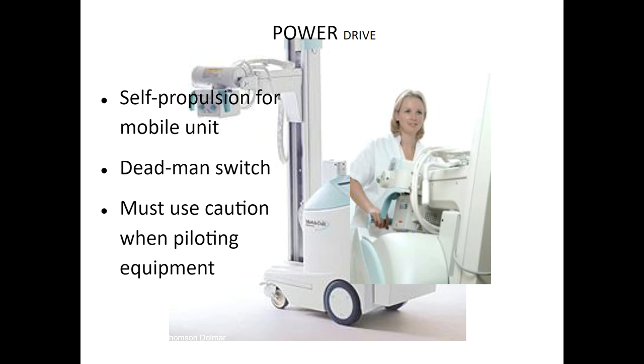Yeah, burn unit's a tough place, right? Making the portable experience even more complex. You have to be somewhat sterile, though it's not like an OR. You have to gown up a little bit. And you have to cover your cassettes for sure.